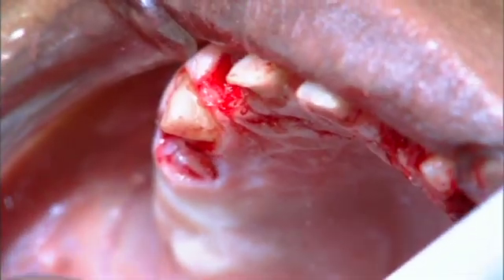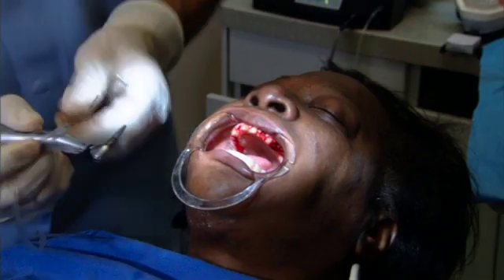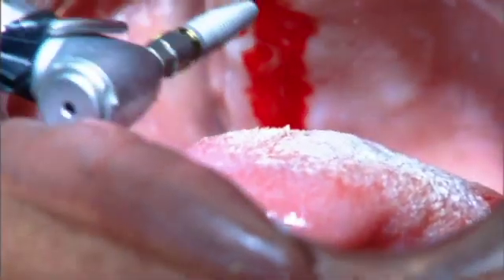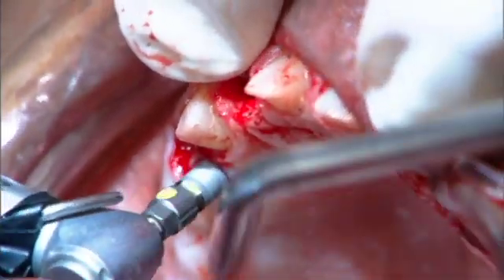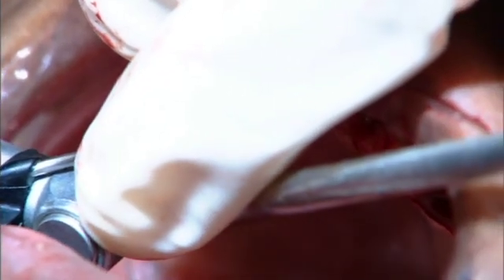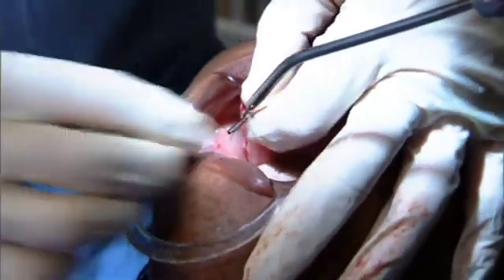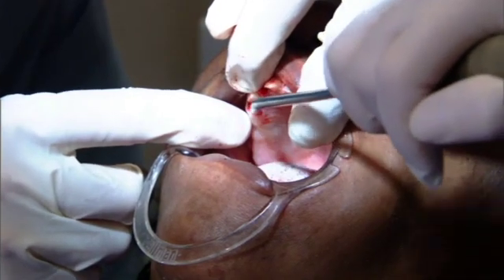We should be really close to this already. There we go. We can go ahead and place our implant on this side. Since we're in maxillary bone, I'm not going to use a screw tap. There's our 4.3 by 13. We're going to be running this at 35 Newton centimeters without water. As you can see, it shuts off right at the 35, and I'll do the rest by hand. Yes, Beverly, this is actually a socket wrench. We know that we've already got 35 Newton centimeters, but my torque wrench will verify that. I can then remove the torque wrench and verify that I'm right at the crest of the bone.